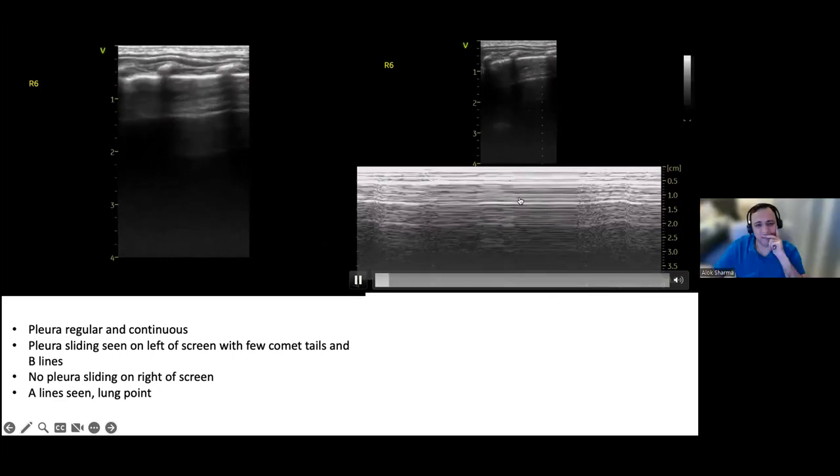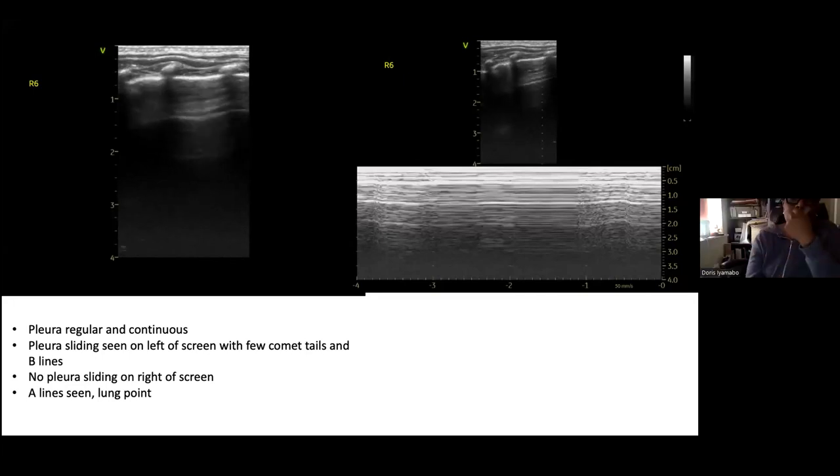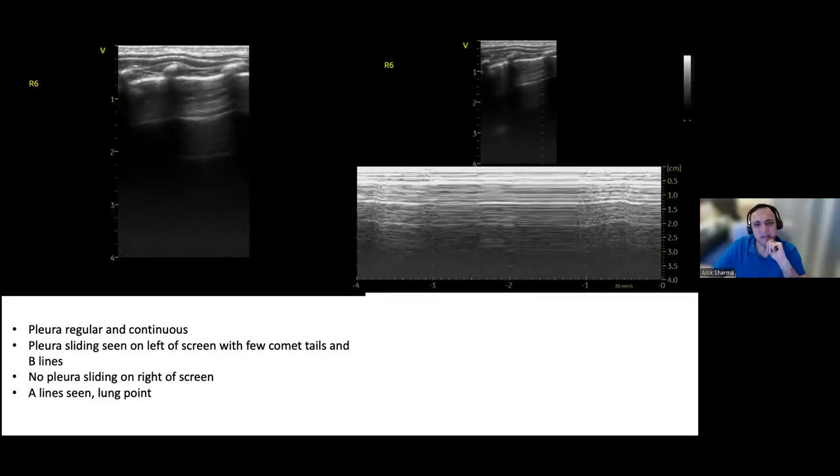Hello? It's a little bit tricky. I'm just having a think while looking at the image. It does look like a barcode sign. But again, you've got a seashore on both sides. And again, from my perspective, the question is that it's not quite straight. You'd have to be doing the scan yourself to correlate.